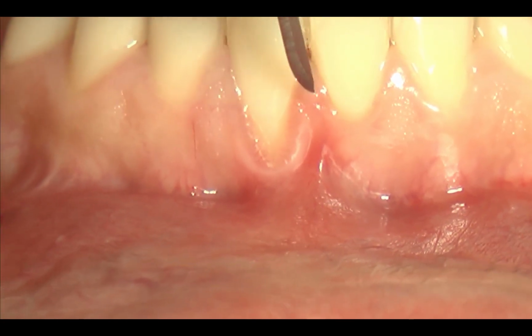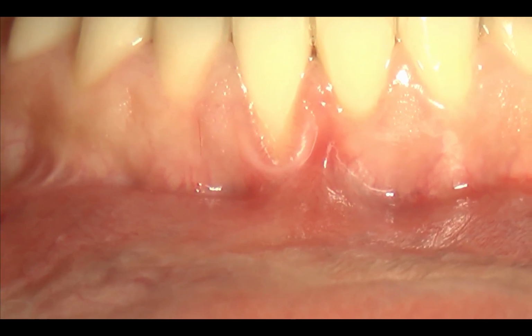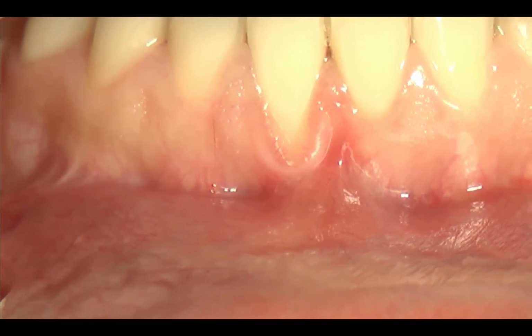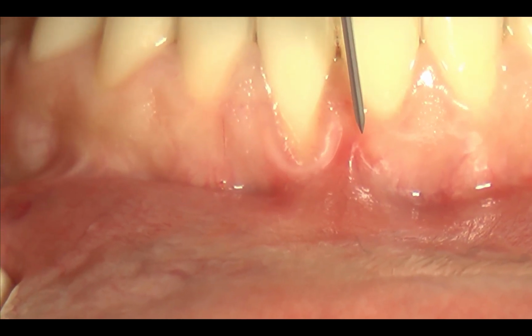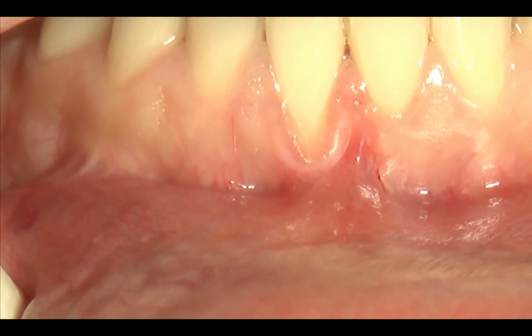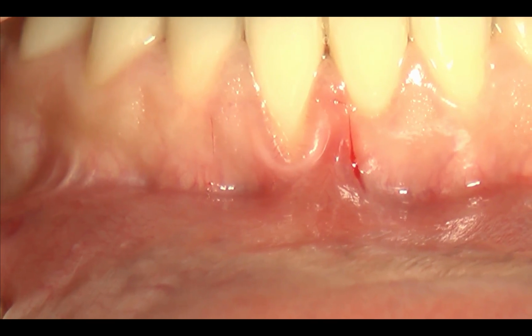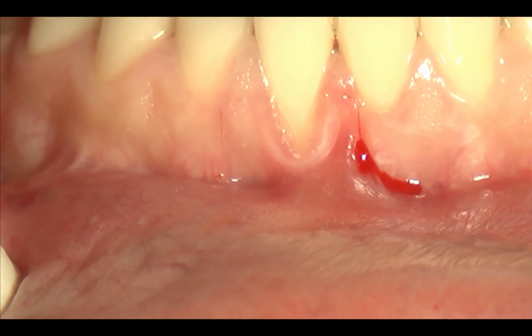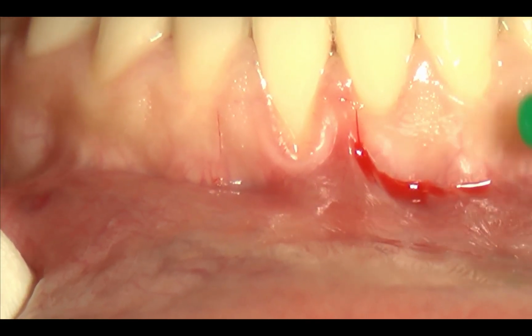And so I have to get as much as possible far from the mucosa of the frenulum, and so I have to place my surgical papilla much more coronal, and I will include also the frenulum in my flap design, otherwise the flap is too small to permit coverage of the connective tissue graft.